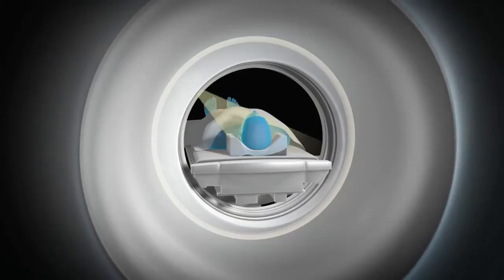Once it goes in, then you take the second slice, the third slice, the fourth slice, like this, right? Sometimes you'll have more X-ray tubes over here. Instead of just one, they put 2 or 3 so that they all work together, and then you can detect a kind of frame-by-frame image of the beating heart.